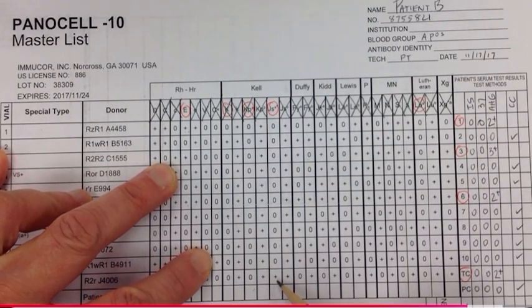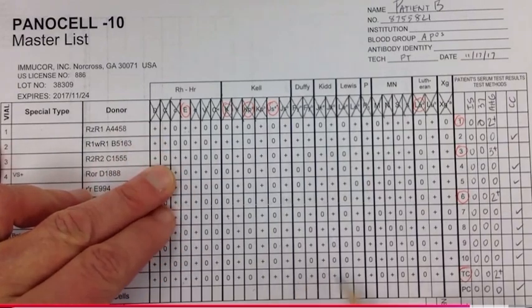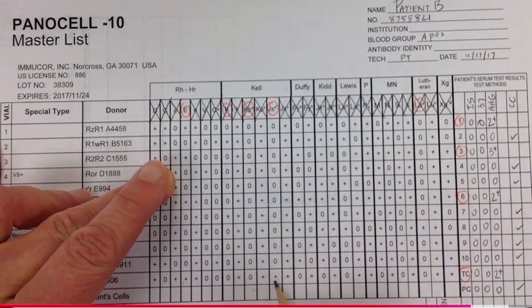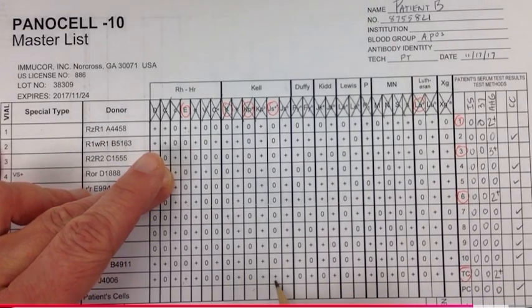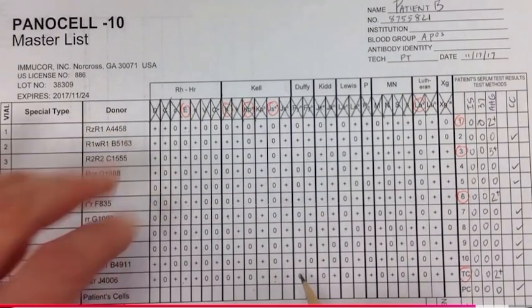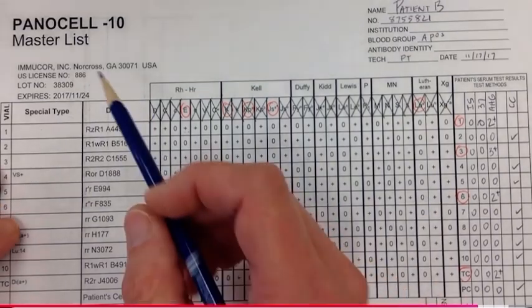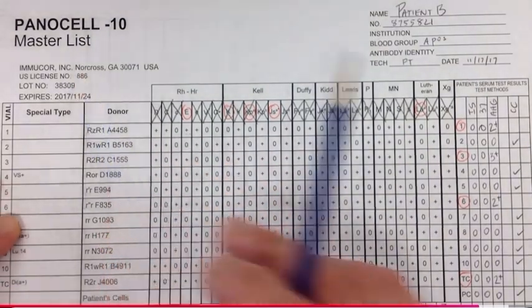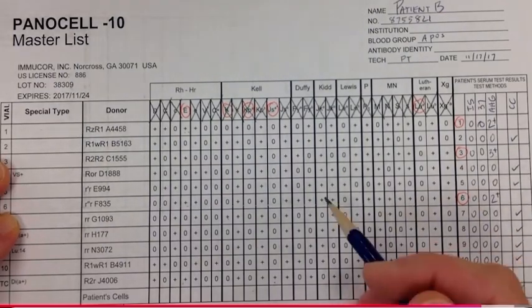Okay, so what are we going to do here with JSA? Because, as I said before, it's positive for a cell that's positive, we don't know if this is being masked by the big E. So we're going to have to go to a different lot number of a panel cell. You can't use the same one, because you're just going to be using the same cells.